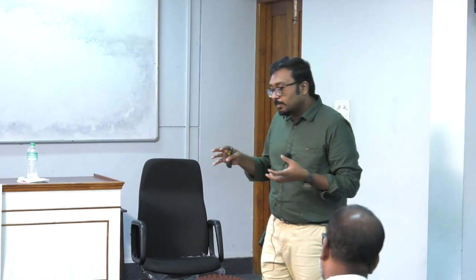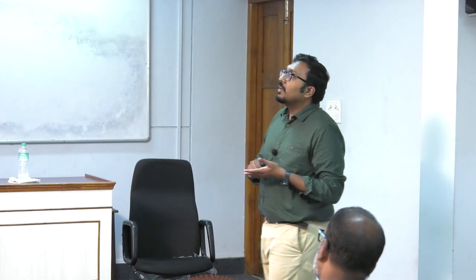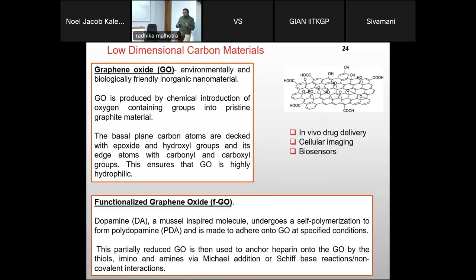So what I had done in that work is we tried to use some nanomaterials to modify it, because there are different types of approaches. You can surface graft the membrane, making it more hydrophilic, grafting to or grafting from, depending on the context. But with all of those, there is always a limitation, or a chance that after some time, it fails, or ensuring homogeneity is difficult.